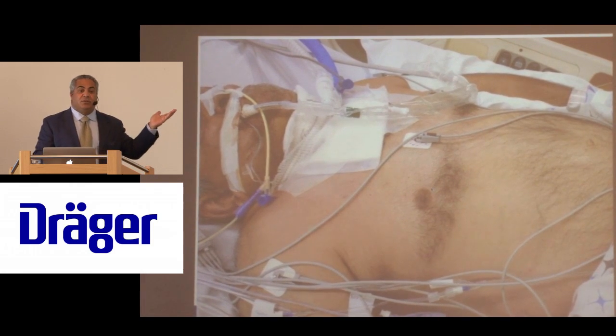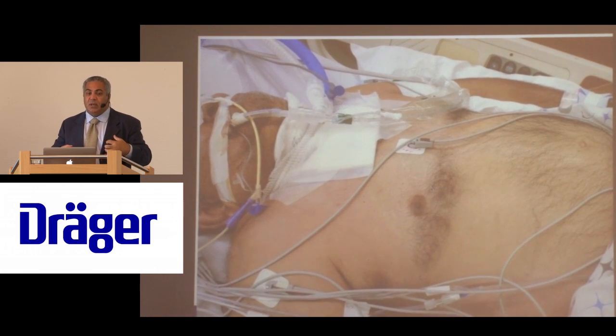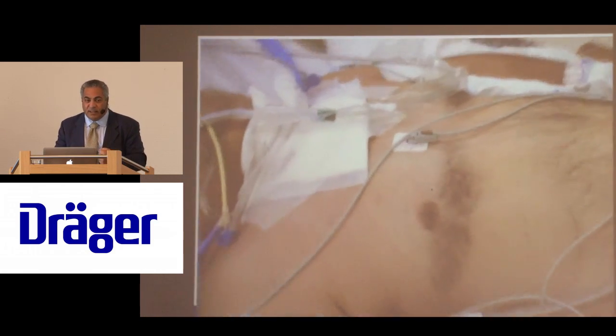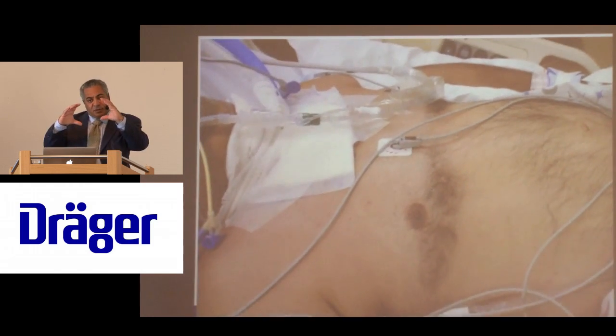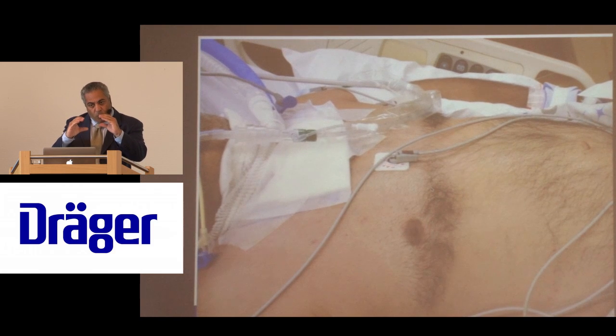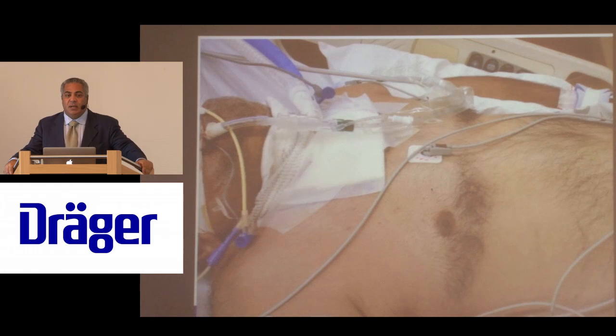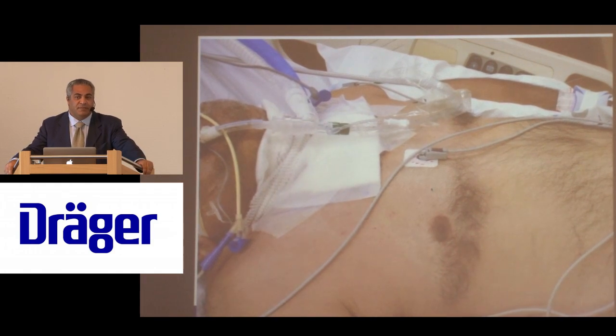Now, if I continue to raise the CPAP level, at some point you're going to see continuous exhalation. They're not going to go like this. They're not going to squeeze and relax, squeeze and relax. They're going to go like this and hold, hold, hold. You're going to be pushing against that the whole time. And of course that suggests that you may have too much.